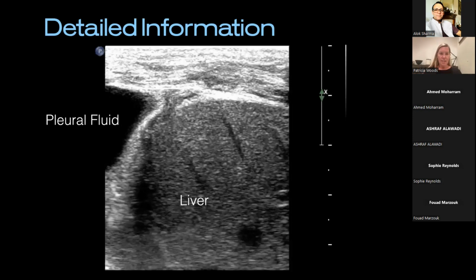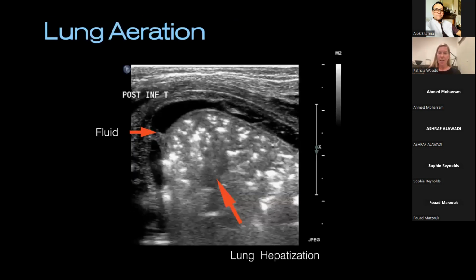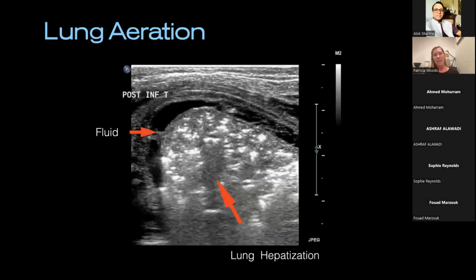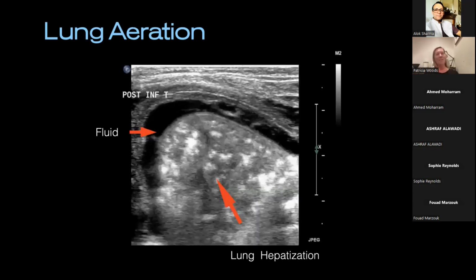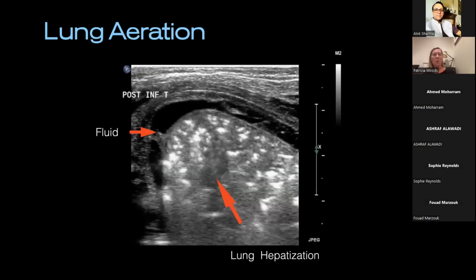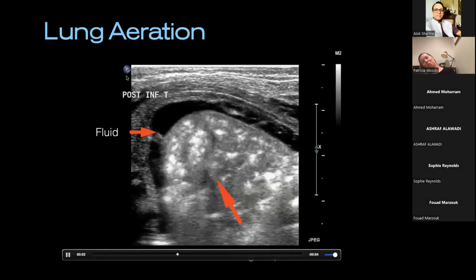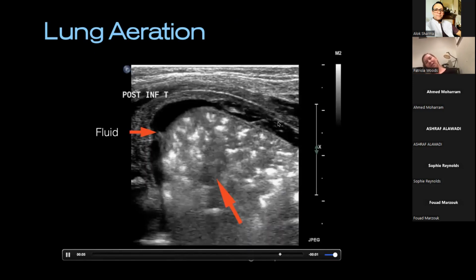Okay, this is an example I think I've shown before, which is a transverse view. So costophrenic angle, but in a transverse plane. You're just taking a slice of the chest inside. Always help yourself with annotation here, because you end up head turning and thinking, hang on, so that probe notch, the laterality is pointing towards the bed. So I think I've got the baby lying down. So therefore this is posterior, this is the side, and this is anterior.